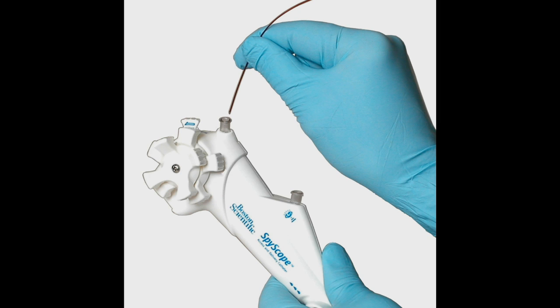EHL works by placing the Autolith Touch EHL probe through the Boston Scientific SpyScope access and delivery catheter. Via the Spyglass endoscope, the physician locates the stone within the saline-filled endoscopic field. The physician then places the probe tip within one to two millimeters of the stone's surface and fires the EHL pulses with a simple step on the foot pedal.